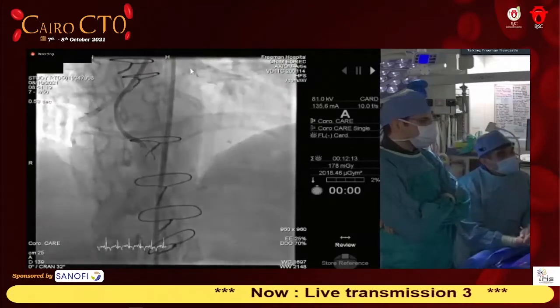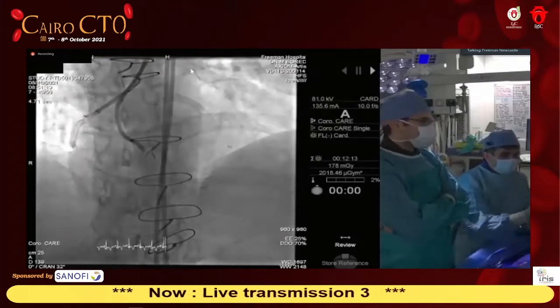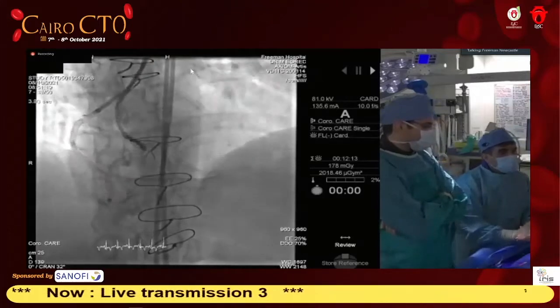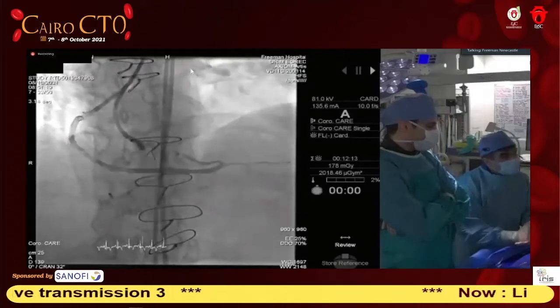And then you've got the LIMA. The LIMA is always difficult because of the tortuosity. Whatever you put through it, it will straighten out and become almost like a concertina effect, and ischemia will ensue. So these are the kind of collaterals that you could use.